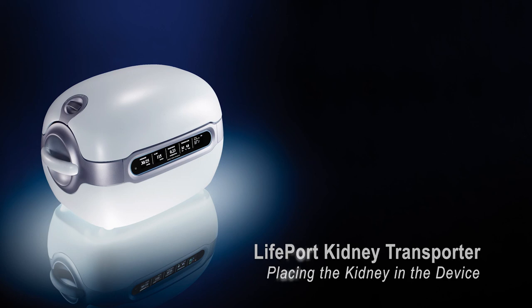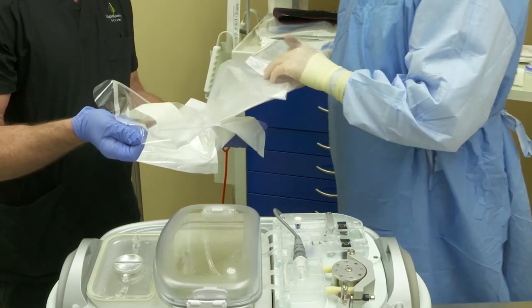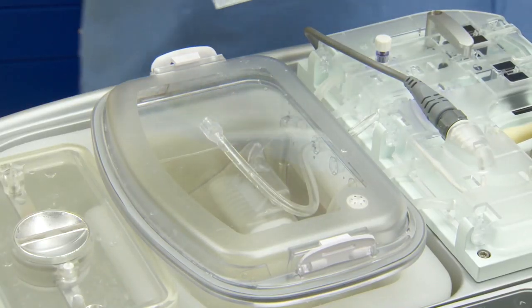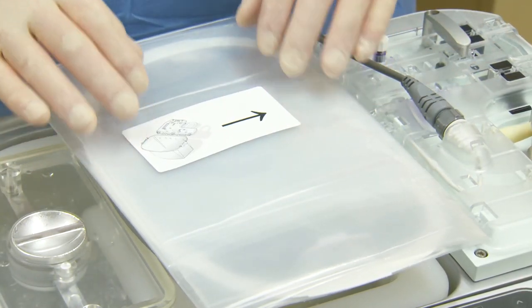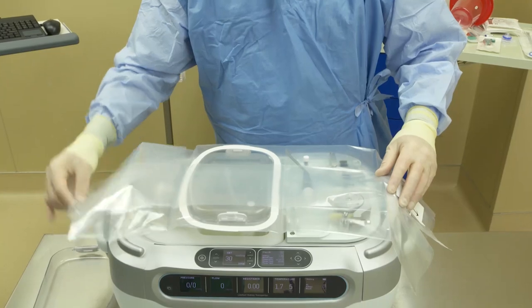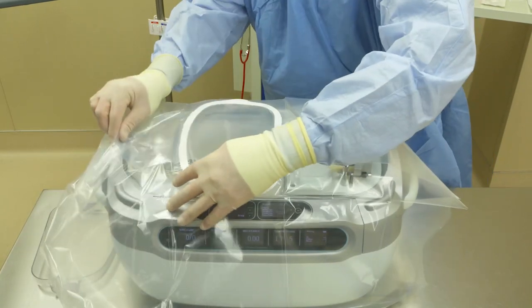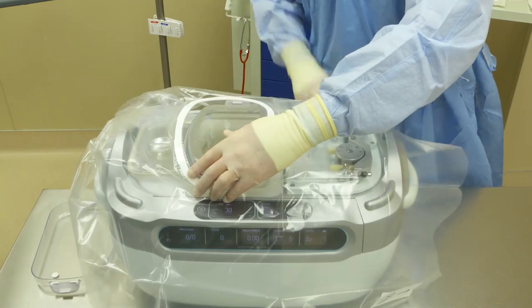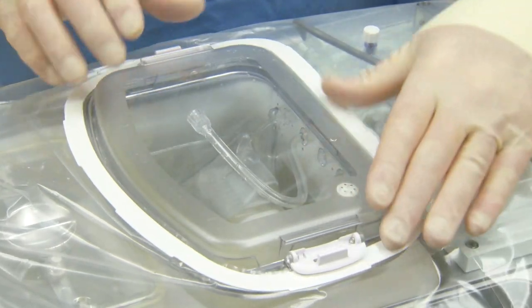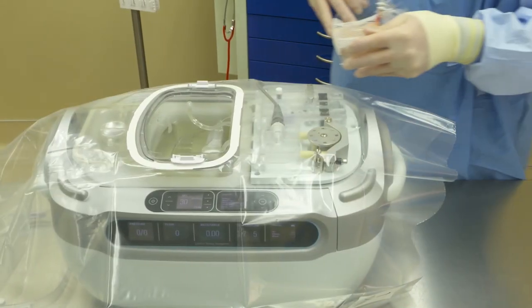Placing the kidney in the Lifeport Kidney Transporter. Now that your kidney is in the kidney cradle, you are ready to place it in the Lifeport. Have someone outside of the aseptic field open the sterile drape and remove the outer lid from the perfusion circuit. Then position the folded sterile drape over the perfusion circuit and unfold it along the length of the Lifeport, then unfold side to side. Position the drape opening around the covered perfusion circuit and remove the inner lid. You can then place the kidney cradle in the perfusion circuit.